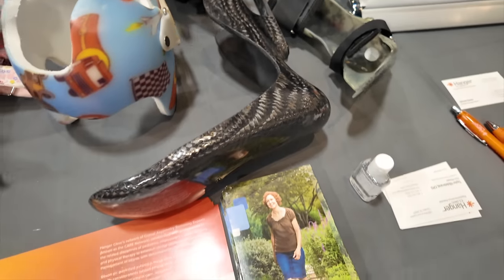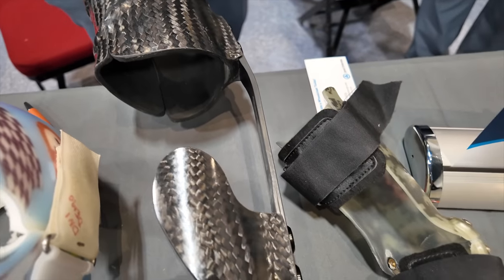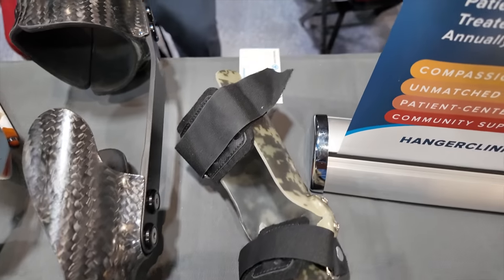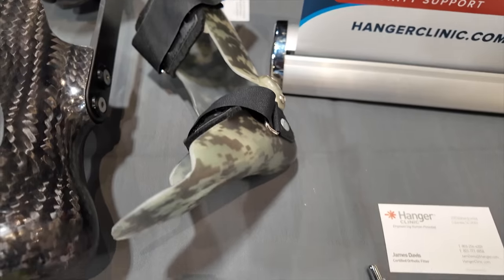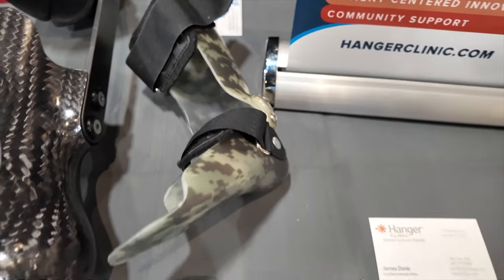More to our higher active AFOs. A lot of military get these when they're coming back with injuries, so they can continue to run. That's carbon fiber. Yeah, it is. And then just little AFOs, especially for little kiddos that maybe are walking on their toes or just have some of that foot drop.